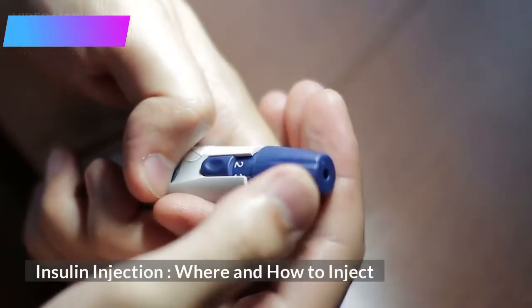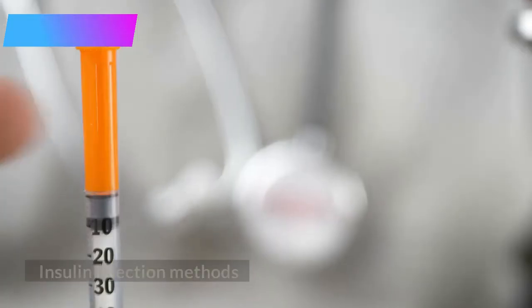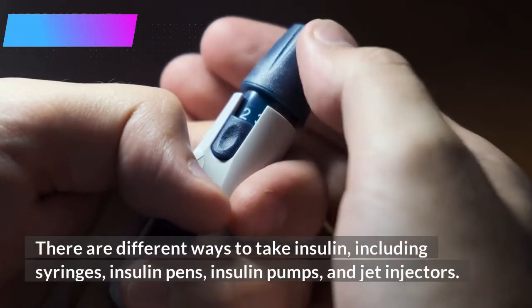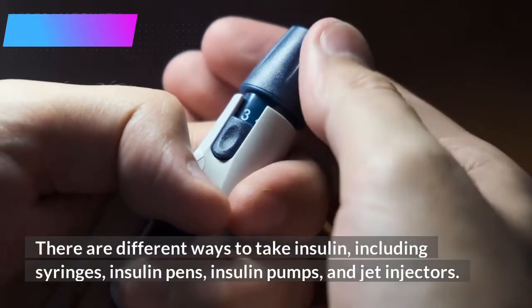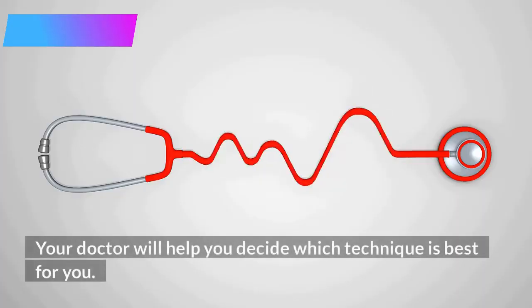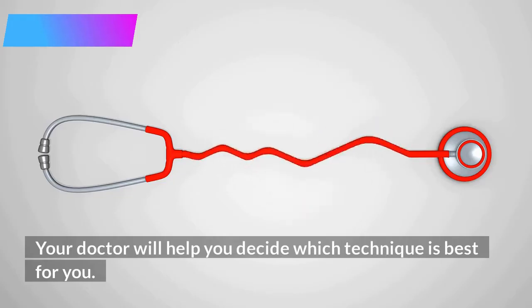Insulin injection, where and how to inject. Insulin injection methods. There are different ways to take insulin, including syringes, insulin pens, insulin pumps, and jet injectors. Your doctor will help you decide which technique is best for you.